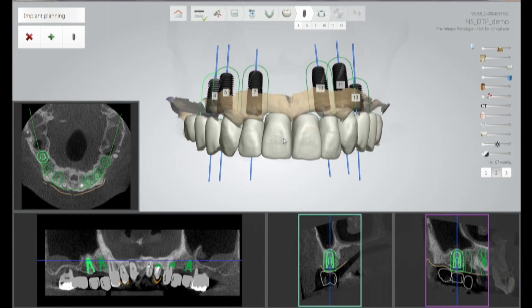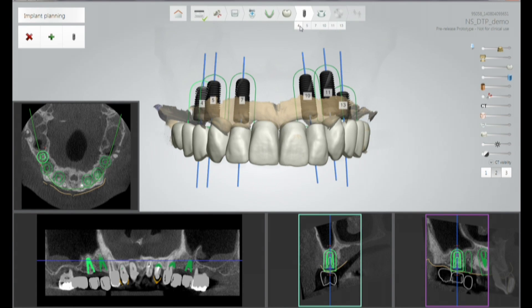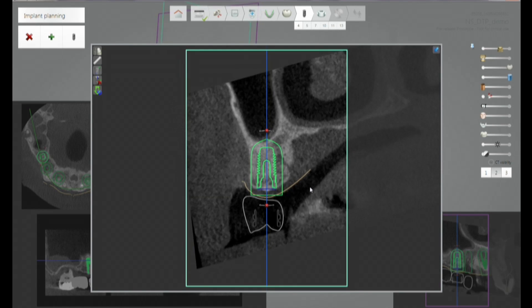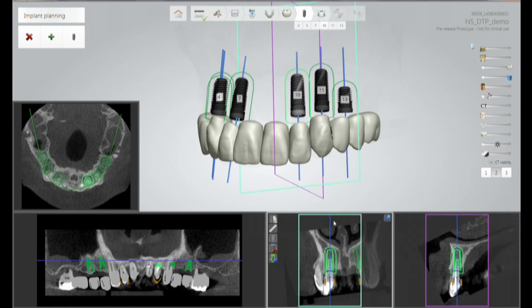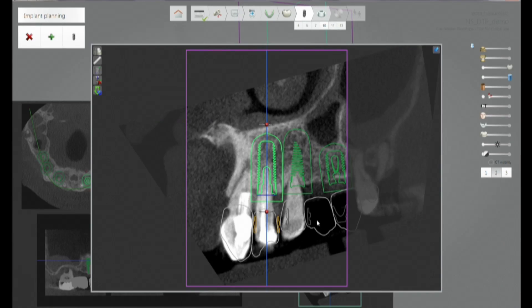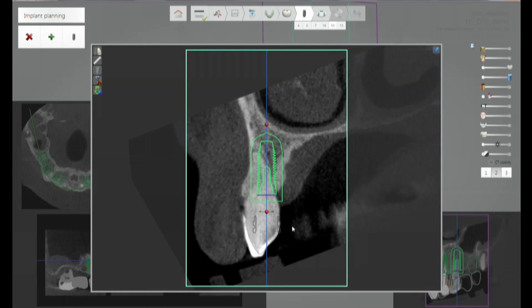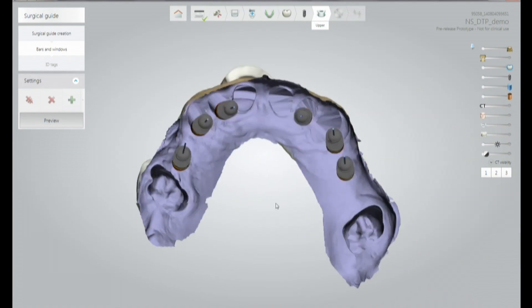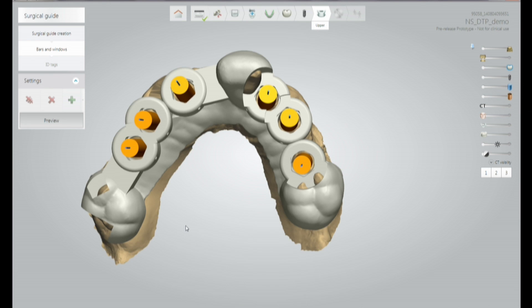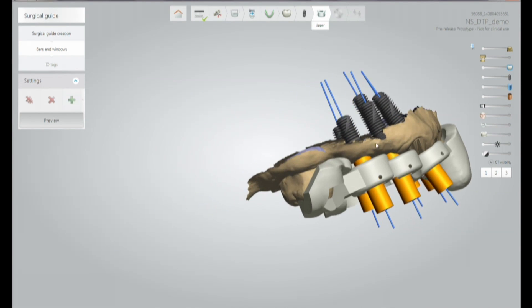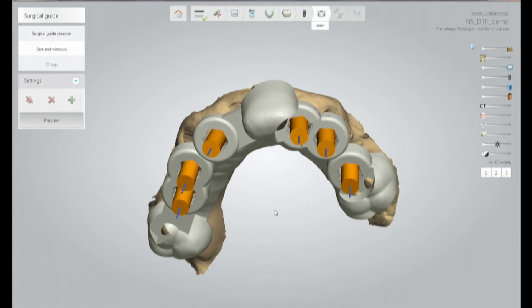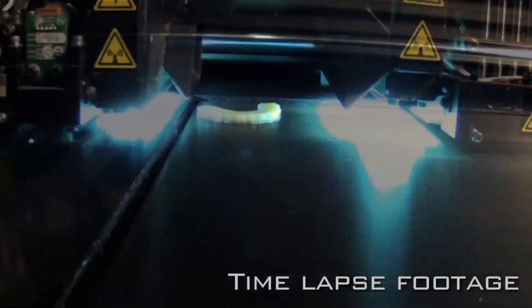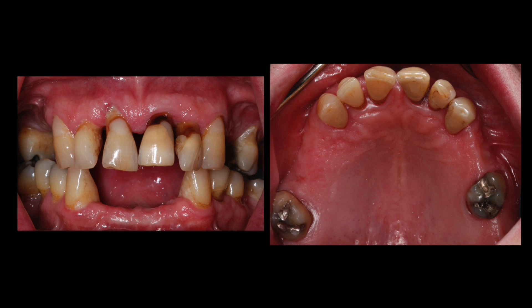We've started with a maxillary arch that needs teeth extracted, digitally extracted several teeth, left a few in place to seat our guide, and designed exactly where we want our implants to go — allowing us to digitally fabricate our surgical guide. This information is then sent to two places: for the surgical guide, it goes to a stereolithography printer; for the temporaries, the file is sent to a CAD-CAM milling machine. Based on the exact location of the implants, the temporary is milled and returned for the second appointment.